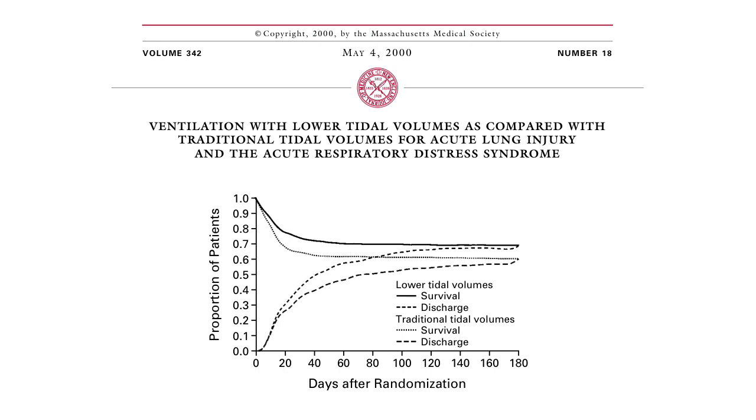In general, for mechanically ventilated patients, we recommend tidal volumes of 6 to 8 cc's per kilo predicted body weight. Tidal volume is normalized to predicted body weight because this correlates to the size of the lung available for ventilation. In patients without acute respiratory distress syndrome or who are recovering in the weaning phase, larger tidal volumes may sometimes be tolerated.